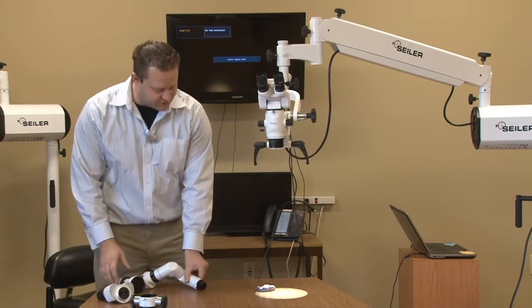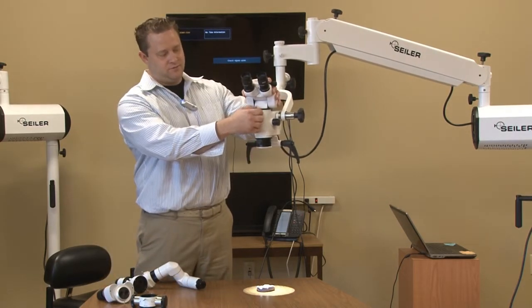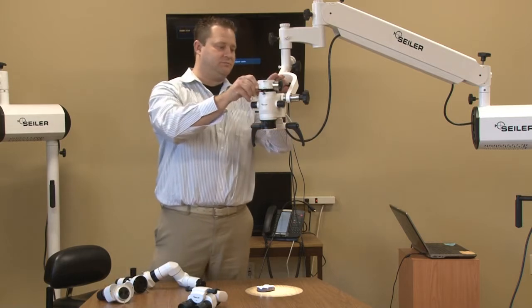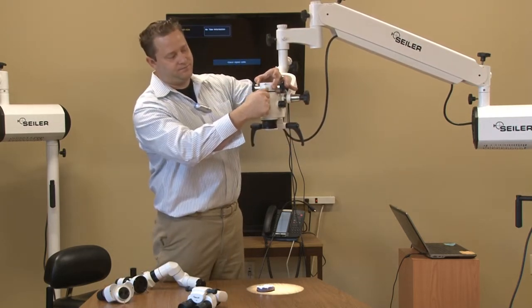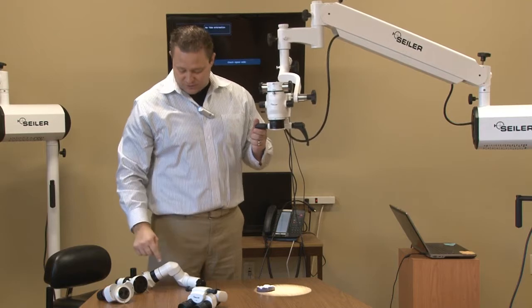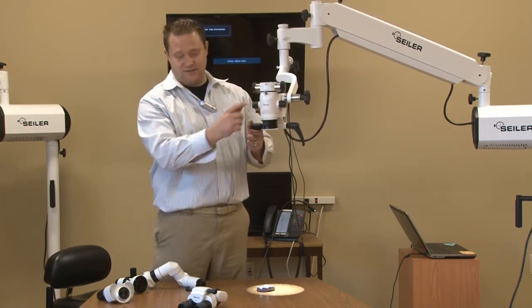So you have your regular surgical microscope. We're going to remove the binocular head. We're going to take the beam splitter and slide it directly onto the microscope. You have two different prisms: a 20/80 and a 50/50. The tube couplers need as much light as possible, so we're going to put it on the 50/50 side.